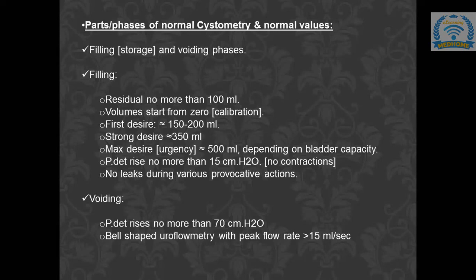Now, normally, the pressure of the detrusor muscle rises no more than 15 centimeter of water in the filling phase. So in the filling phase, the detrusor pressure should be less than 15 centimeter of water, and there should be no leaks during various provocative actions. That means when the patient is coughing, laughing, sneezing, or doing any Valsalva maneuver, there should be no leak during the filling phase.